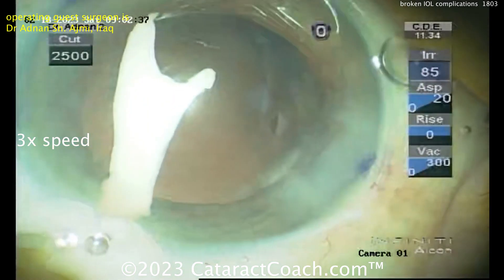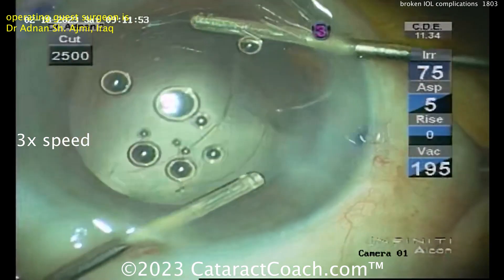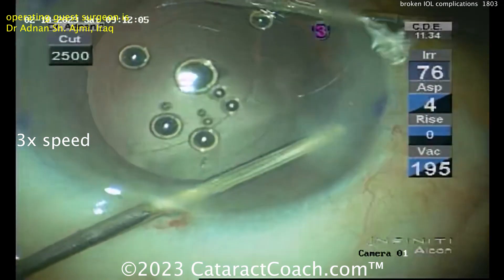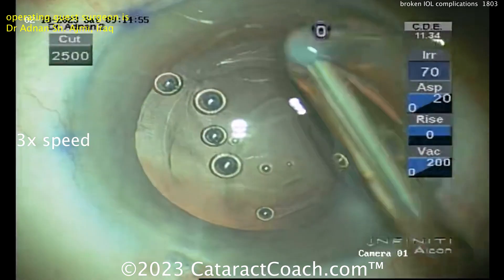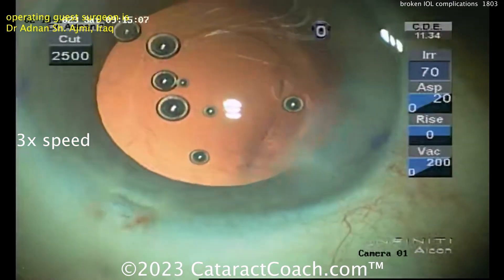Put some Triamcinolone in to stain the vitreous and see what you've got. Already in vitrectomy mode — clean up any prolapsed vitreous. Luckily the vitreous is cleared from the anterior segment and you have a nice-looking rhexis, fortunately. So it's time to put in a three-piece lens. There you go — nice-looking rhexis still. We can still put a three-piece lens in the sulcus.